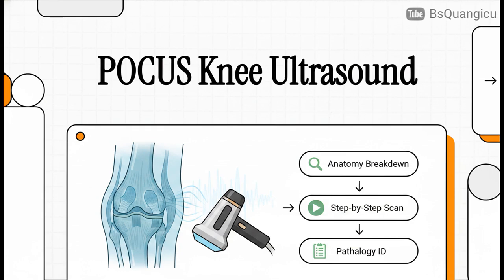If you've ever felt totally overwhelmed by the complex anatomy of the knee, or maybe you've been unsure if you're looking at a true tendon tear versus just some physical artifact, well, you're in exactly the right place. Today, we're taking those dense clinical guidelines and transforming them into a highly visual, completely reproducible system.